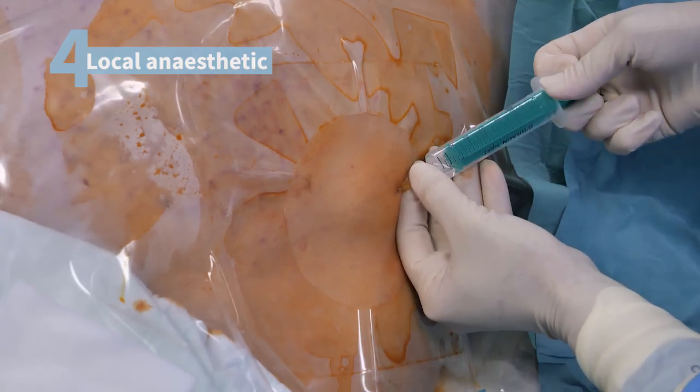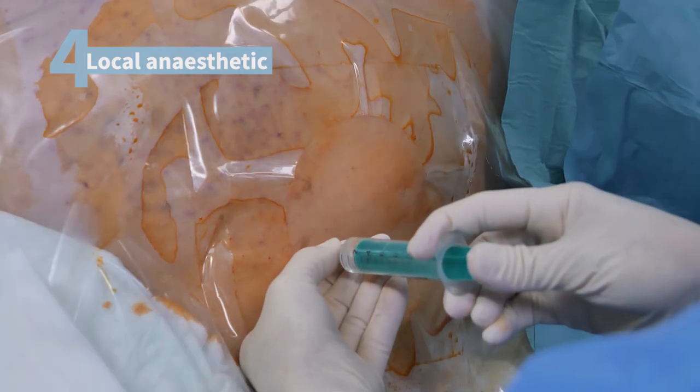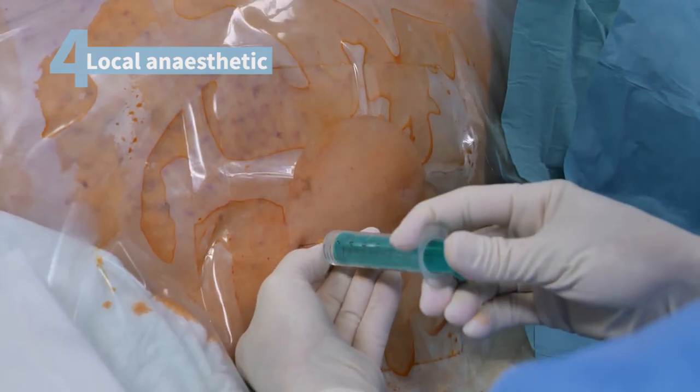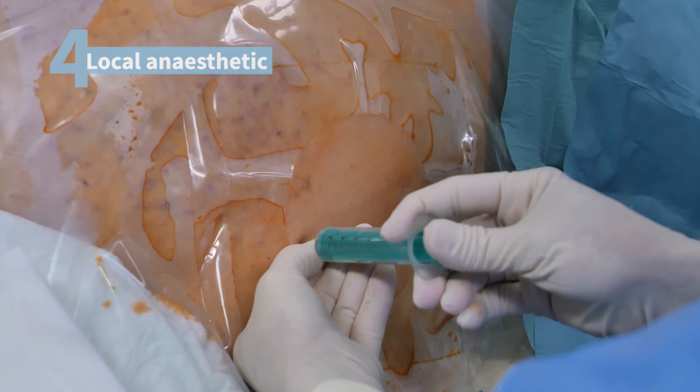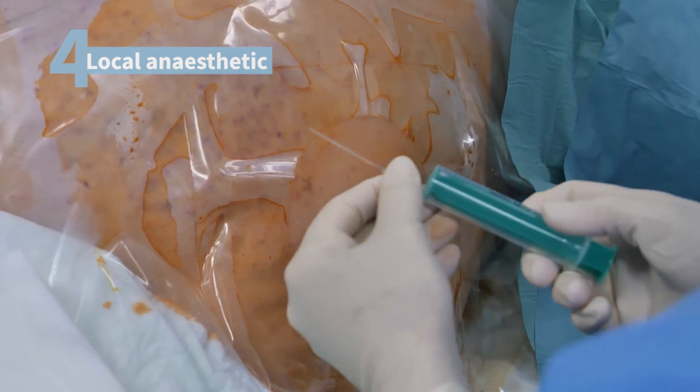It is incredibly crucial to ensure that deep anesthesia is effectively achieved. Wheals will also be formed in the region surrounding the incisions, as well as at the later locations where the sutures will be placed.